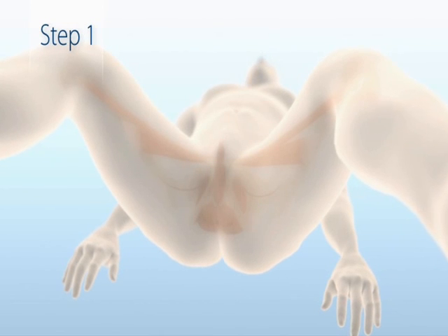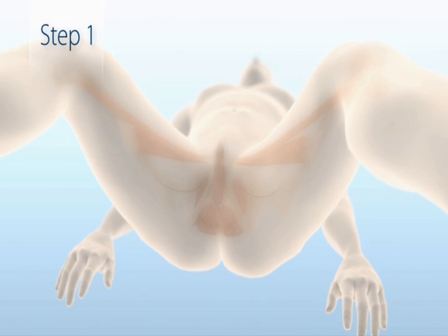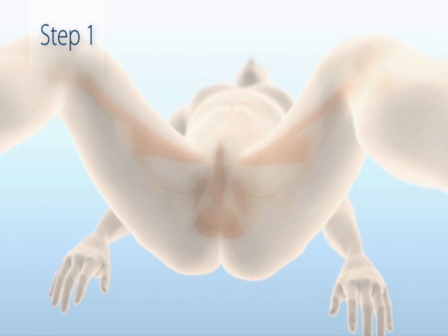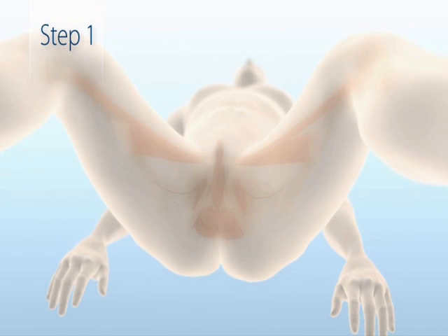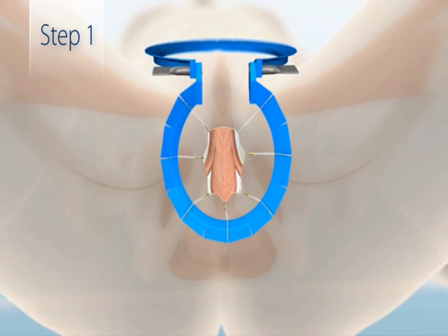To prepare for the Advance XP male sling procedure, the patient is placed in dorsal lithotomy position, with legs bent at 90 degrees and slightly spread, no further than shoulder width apart. The procedure begins with a low midline perineal incision through the skin and subcutaneous tissues.